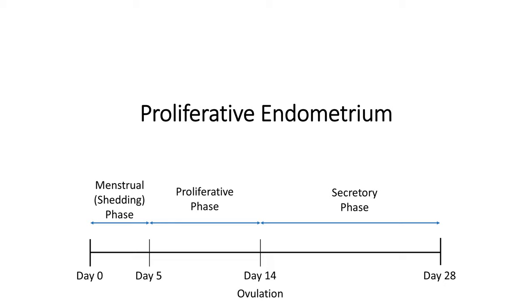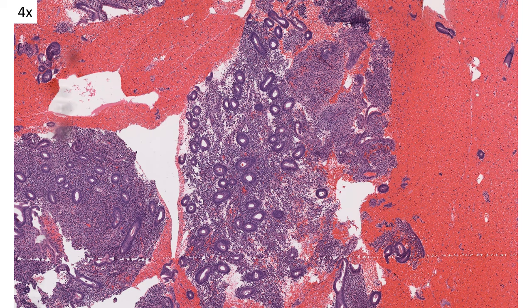Let's talk about the proliferative endometrium — the endometrium seen between days 5 and 14 of the cycle. At low power, the specimen looks very blue. The stroma is quite cellular and the glands themselves are cellular, but there's a decent, even spacing between the glands. There are no areas that look really crowded with glands, which is important because we're often evaluating for pathologies such as hyperplasia. The contour of the glands looks very round from low power, which is an important feature to compare against other phases.